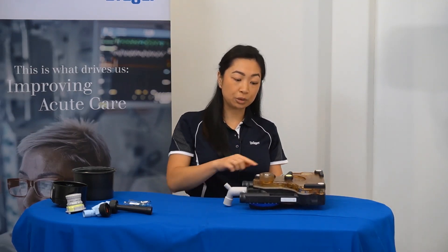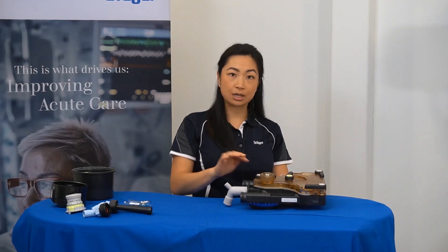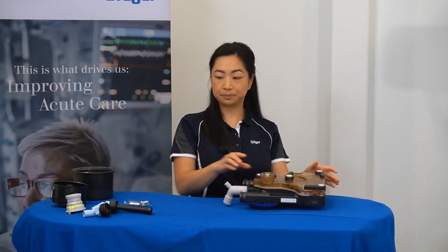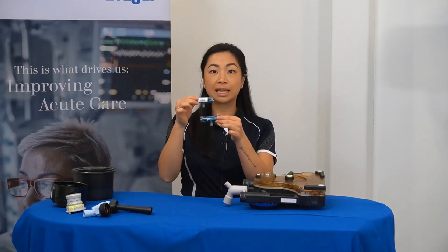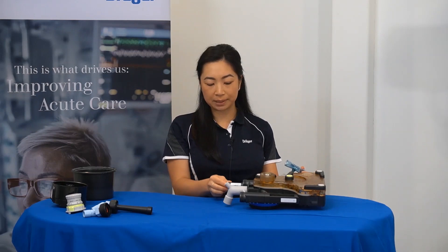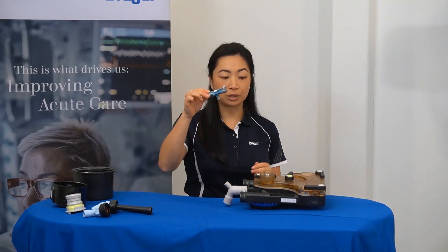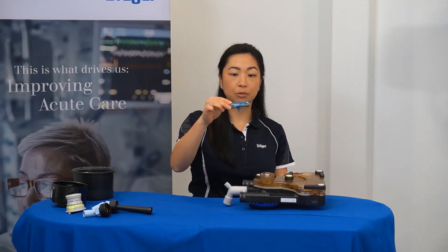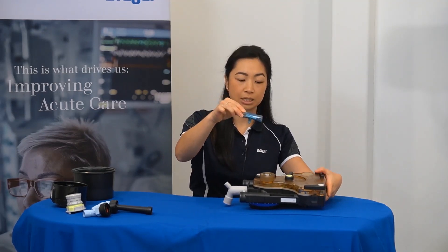At this point, you should inspect that the breathing system cover is fitted correctly and there are no gaps. Following that, your clean flow sensors can be inserted. The inspiratory one by sliding it in at the top, and the expiratory one goes in the middle.